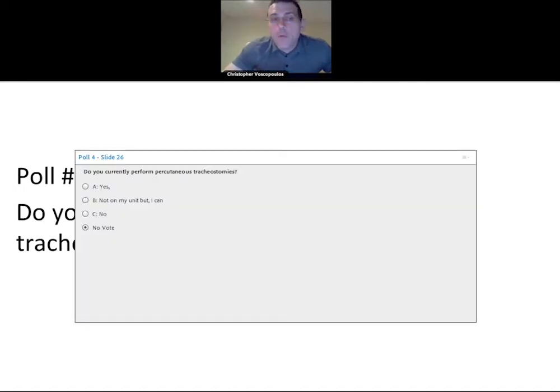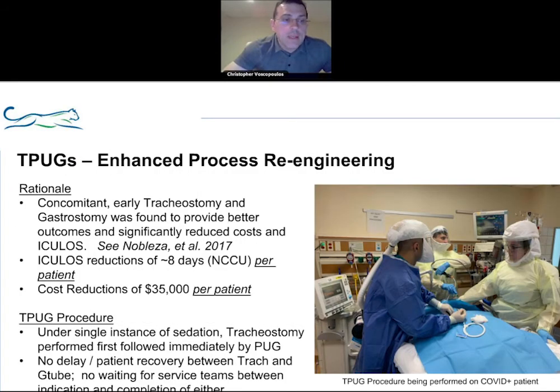So I think this is our last polling question here: do you currently perform percutaneous tracheostomy? The majority of people, I have 5 answers here for people who do and 3 that do not. So for those that currently do perform percutaneous tracheostomies, you will be able to relate as I move on here. And for those that don't, I would encourage you to try to incorporate that skill into your practice so that you can combine these techniques.